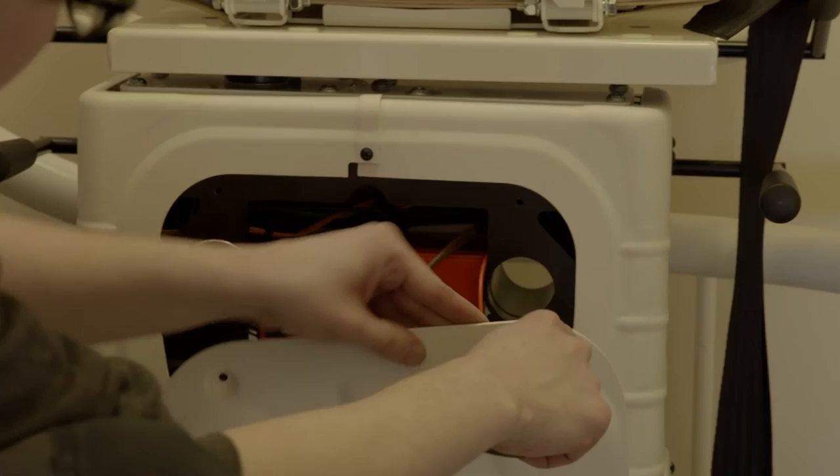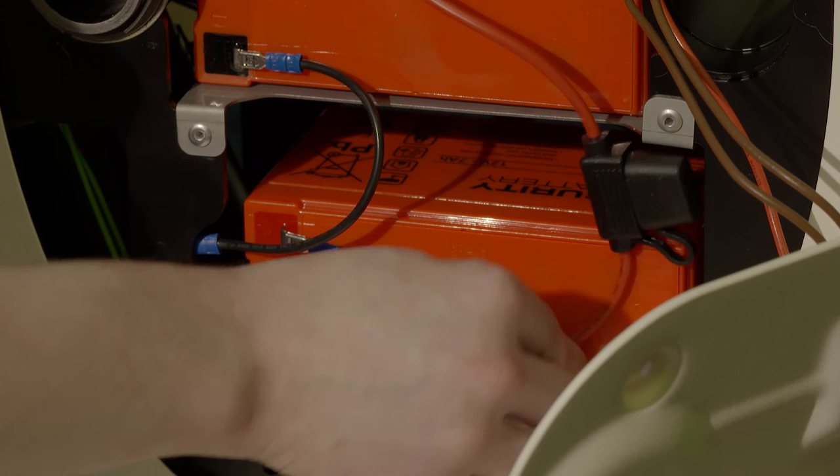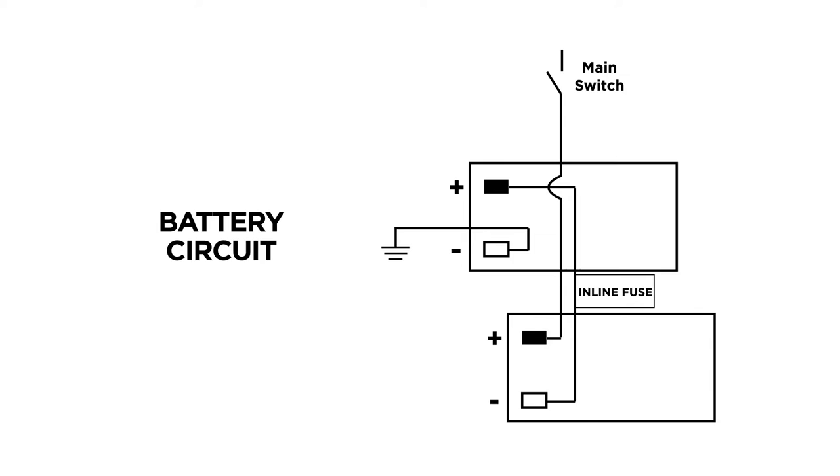To install the batteries, first remove the front panel by unscrewing the four main screws. Once you have inserted the batteries, consult your instruction manual, making sure the battery circuit is correct.